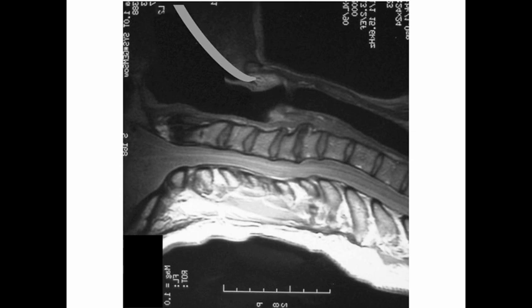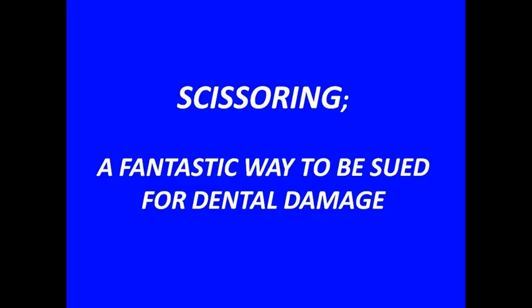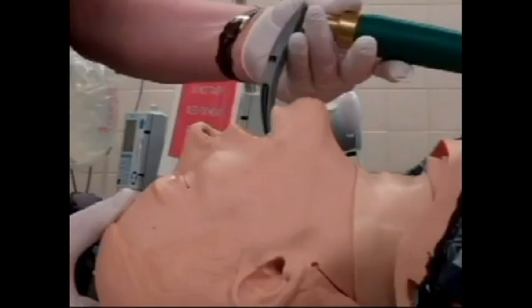At this point, some intubators will attempt to pry the mouth further open to facilitate insertion of the laryngoscope blade by a technique called scissoring, where finger and thumb push on the right side of the upper and lower teeth, that is the teeth in the upper and lower jaw on the right side of the mouth. But I have to tell you, I discourage this, and I solicit caution if the intubator must do this. The correct application of the first and second airway maneuvers nearly always causes the mouth to pop open enough for insertion of the tip of the laryngoscope blade.